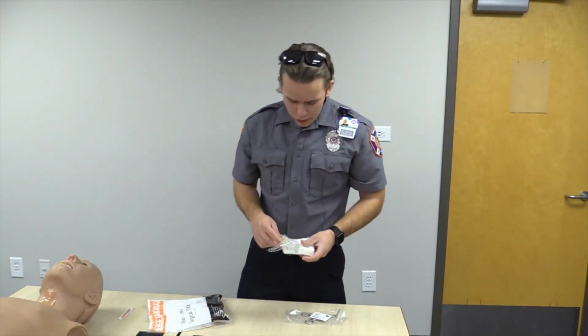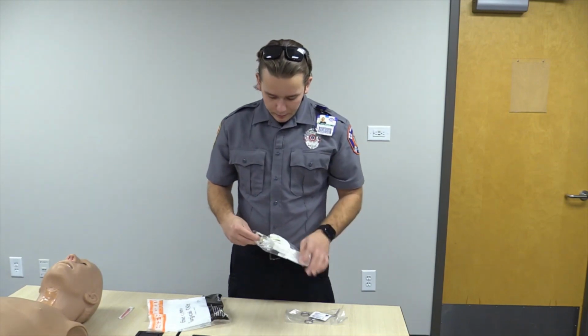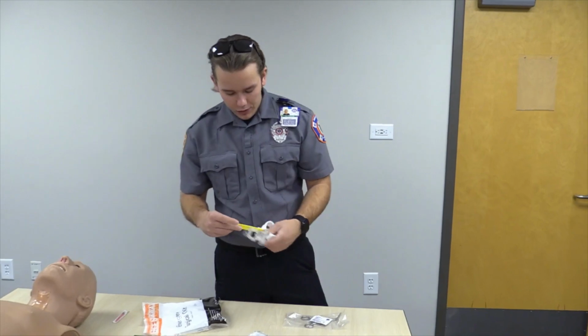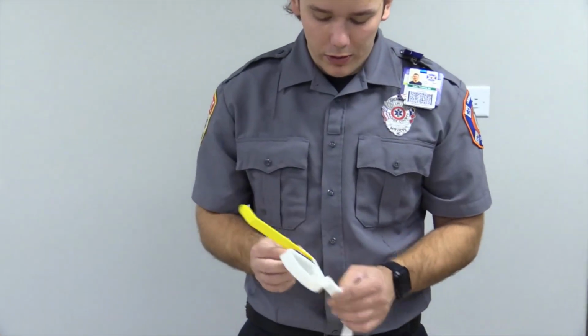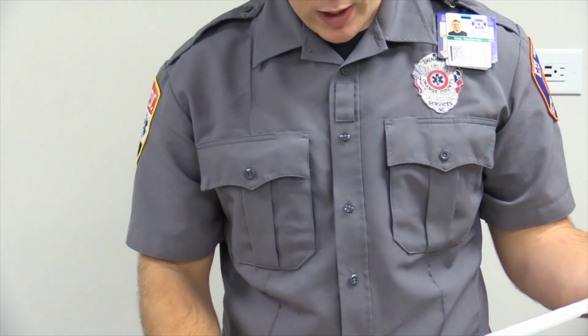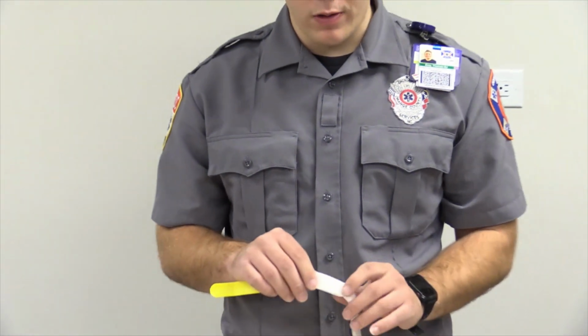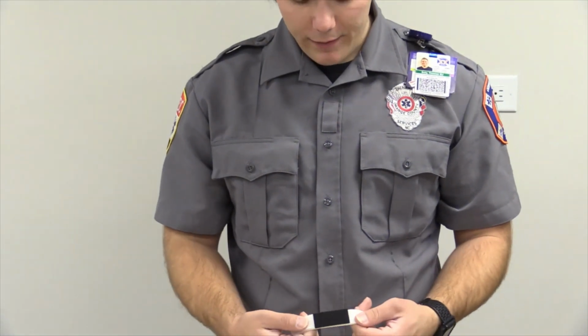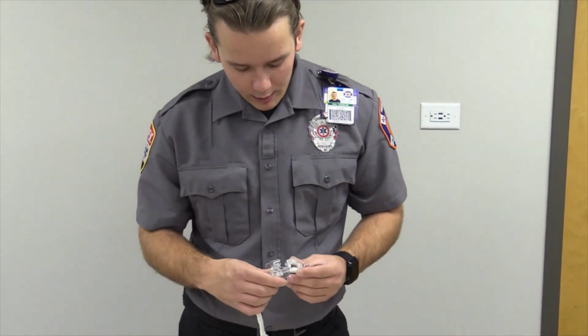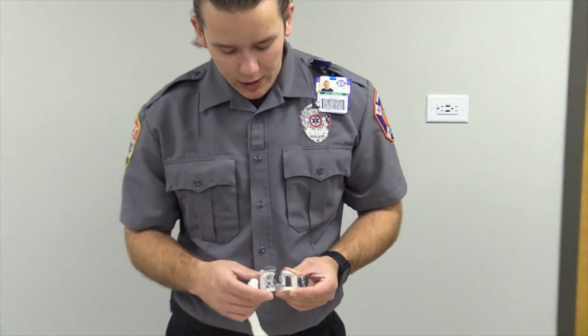And we have a new securement device here. It appears to be pretty similar to our Thomas ET tube holders that we use for our ET tubes. But as you see here, this is a white strap. We're going to have white Velcro on this side, black Velcro on this side, and here's the hole that the tube is actually going to go in.